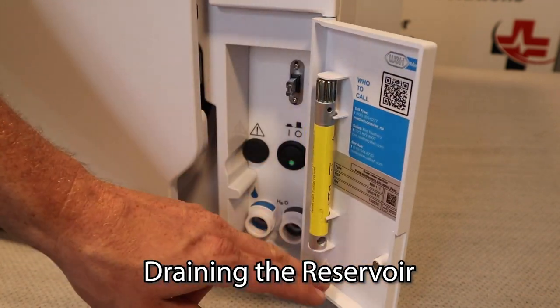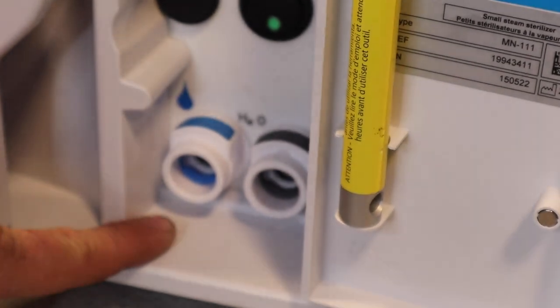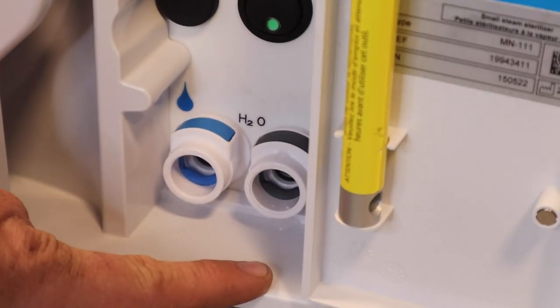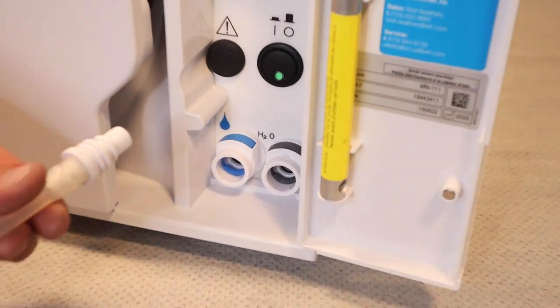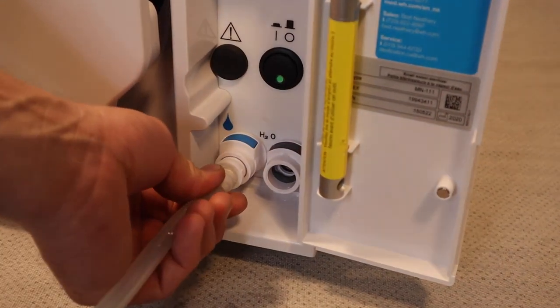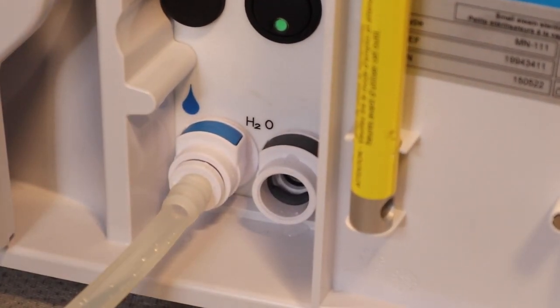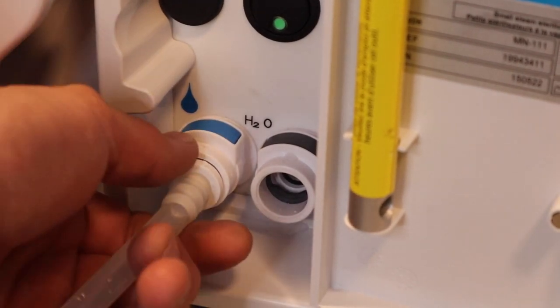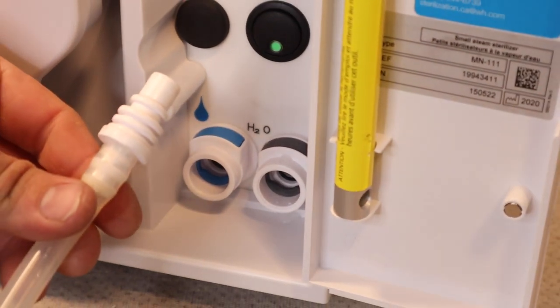Behind this front panel you will notice you have two ports. The one on the left that's blue is for your fresh water. The one on the right that has the black tab on the top is for your wastewater. To drain either reservoir you simply take the easy to use quick connect and insert it. You will hear a snapping noise and at that time any water that is in that reservoir will come out. To release, push down on that colored tab and pull out, and that quick connect will release.